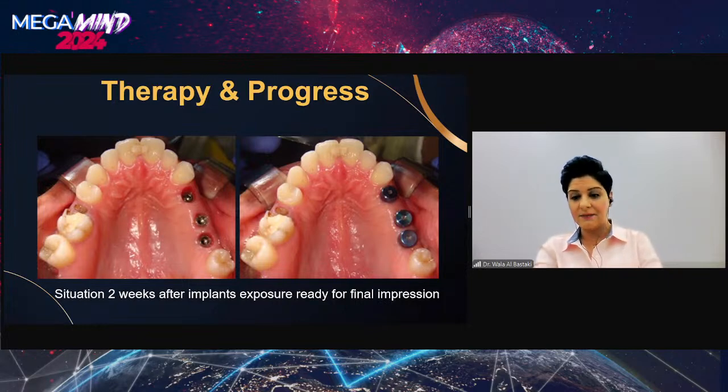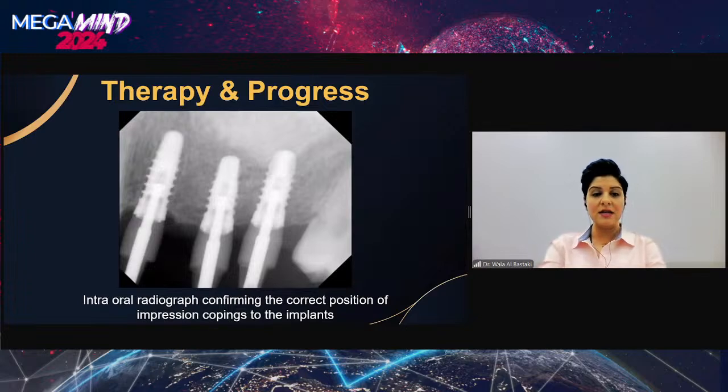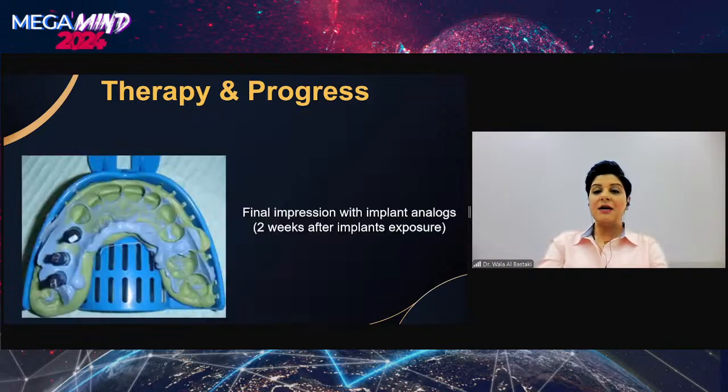It looks amazing. This is the impression copings in the patient's mouth, and I always like to take an intraoral radiograph confirming the correct position of the impression copings to the implants. Final impression with the implant analogs 2 weeks after implants exposure.